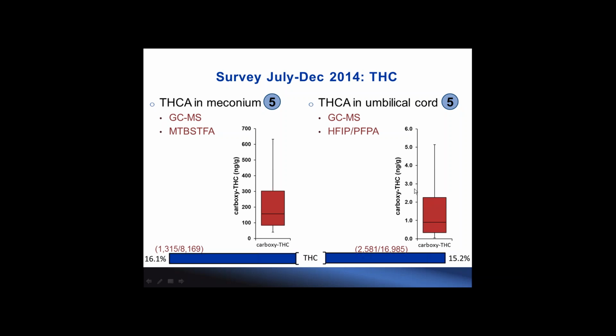And in our lab, we set up the cutoff at the concentration above which our test methods are capable of resulting in very accurate and precise quantitative results. So that doesn't mean the negative results mean that drug is not present in the specimens.